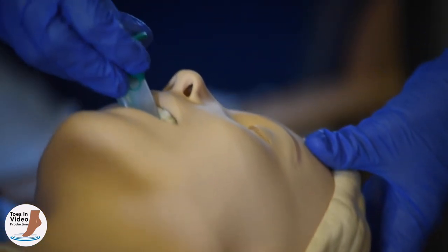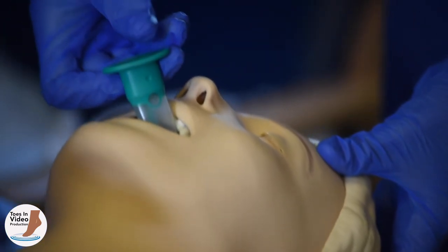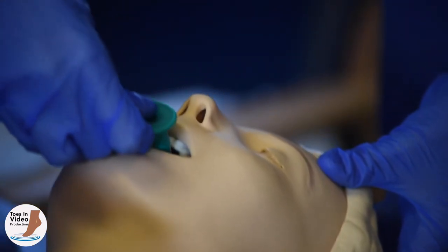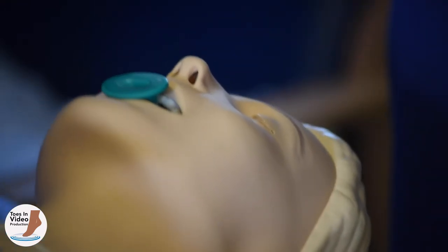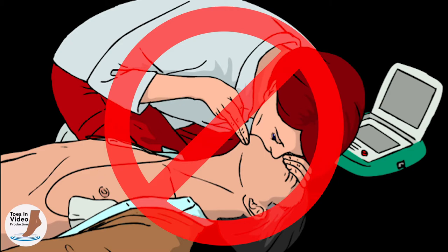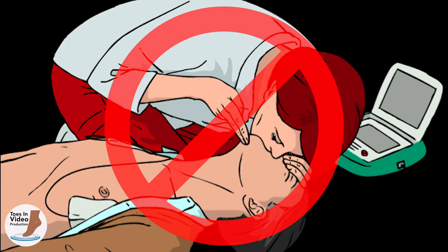Insert the airway curving upwards into the patient's mouth and slide it back until you feel resistance. At this point, rotate the OPA 180 degrees until it rests comfortably in the patient's mouth with the flange resting on the patient's lips. At no point are you expected to give mouth-to-mouth breaths to any collapsed patient in your role as an NHS employee. If you have no access to any airway rescue device or equipment, give compression-only CPR while summoning help or equipment including an AED.